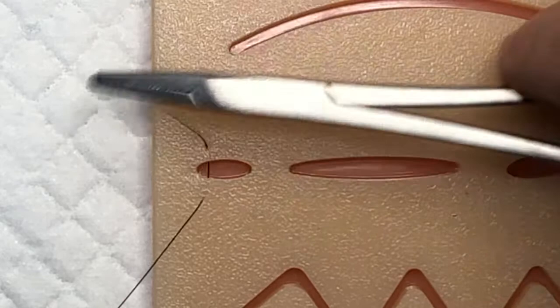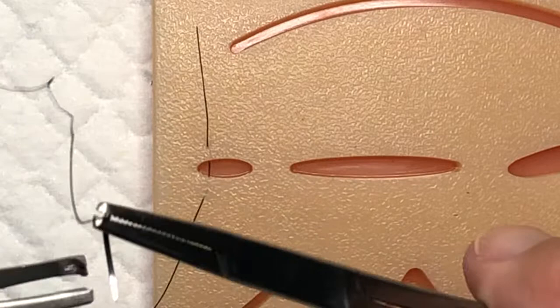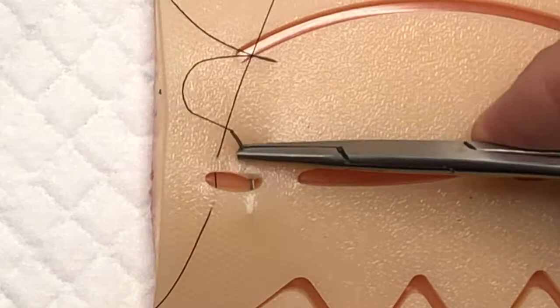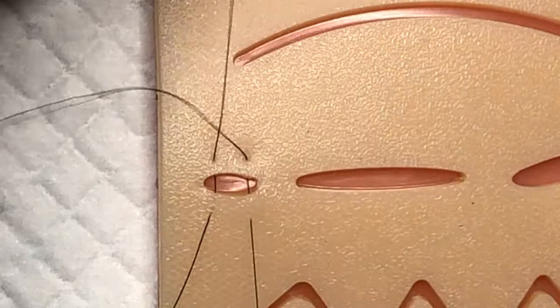In that previous video, you can see I actually pulled a little bit too much and pulled the suture all the way through — that's something that happens when you get in a hurry, and you have to start over. Just one of those annoyances of practice. With a better handle on the needle, we're going to put this one through right here, using our tissue forceps to grab the needle and the needle driver and pull it through.